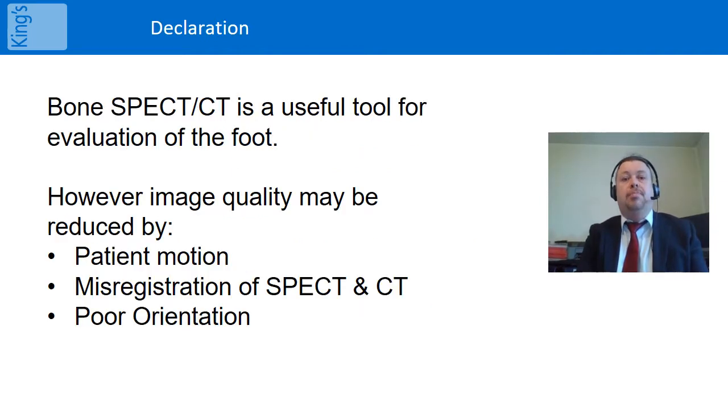As you know, a bone SPECT CT may be used to evaluate a number of clinical conditions involving the feet. However, the usefulness of the test may be impaired by such things as patient motion, misregistration of the nuclear medicine and CT data, and poor orientation of the images.